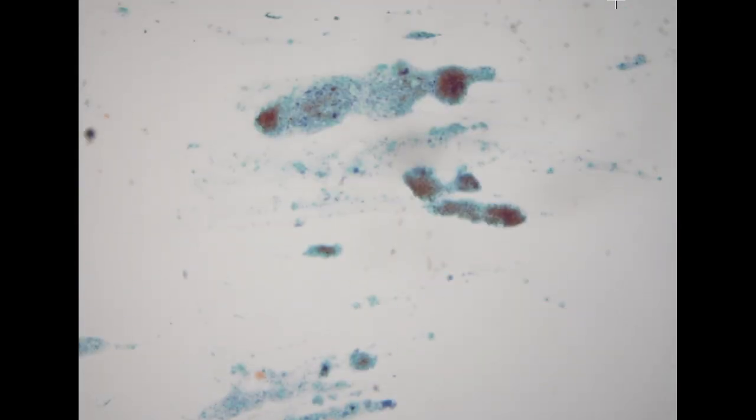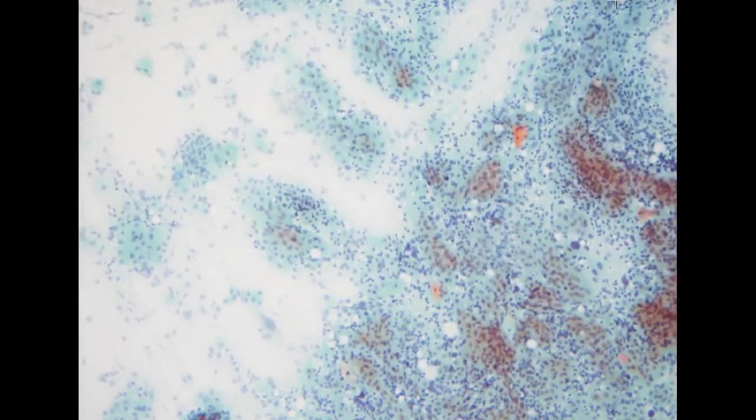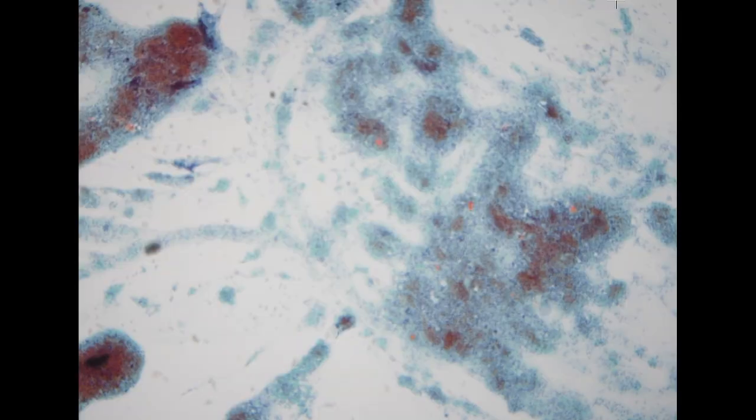So the next specimen is coming from a 67-year-old female, who is already in the postmenopausal stage. So on low power, you can see this is totally different from the prior specimen. We see more inflammatory debris. Most of the cells are intermediate cells in larger fragments instead of individual cells. And we also see a lot of naked nuclei in the background. So this is a classic pattern for an atrophic smear.